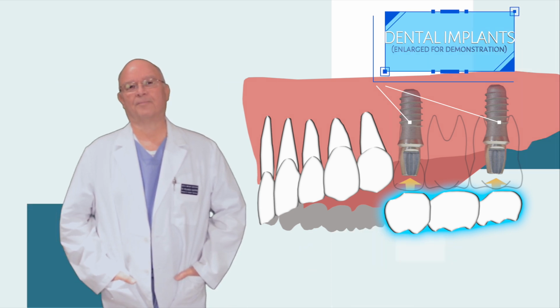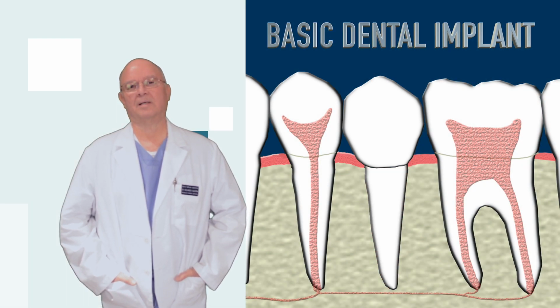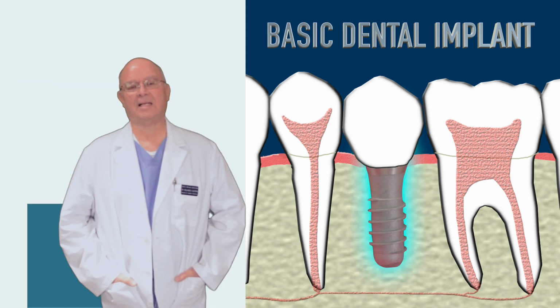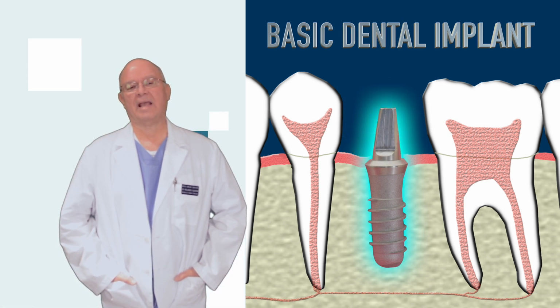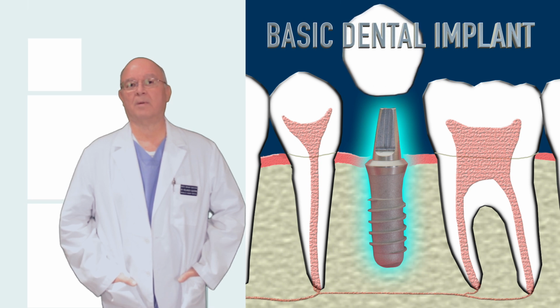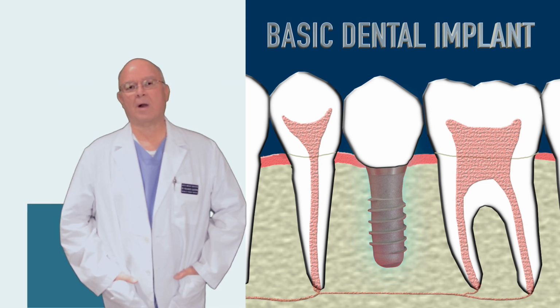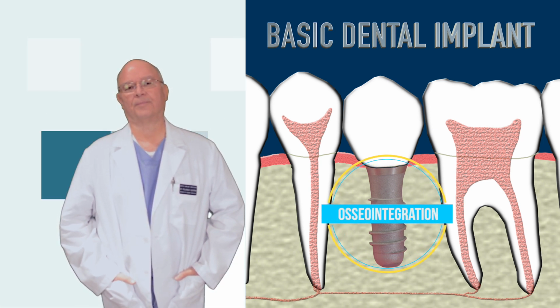A dental implant, in its most basic form, is a root-shaped structure made of a metal called titanium. This root-like structure can be placed into the bone where the tooth was, and after a certain period of time, ranging from 3 months to 8 months, the bone where the tooth was will grow around and grab that implant. That process is called osseointegration.